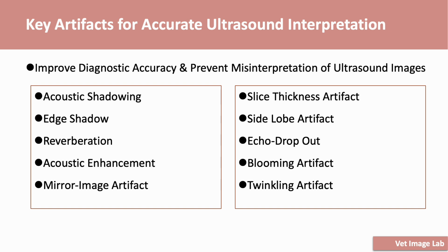To fully understand these ultrasound artifacts, it's important to grasp the principles behind how ultrasound images are generated. For those who want to review the basics, I've included a link in the top right corner to our previous lectures. Now, let's take a closer look at each artifact and see how we can use them to improve diagnostic accuracy.